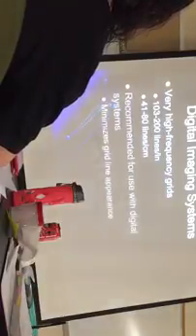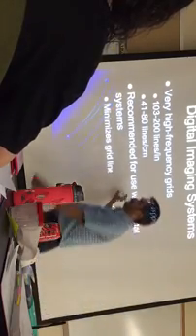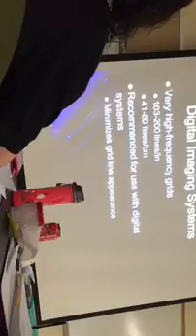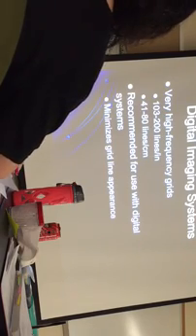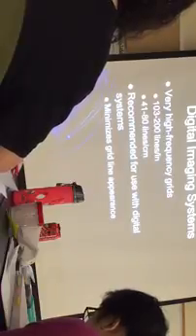Also, very high frequency grids can have from 41 to 80 lines per centimeter. If you're using a digital system, it is highly recommended that you use high frequency grids. High frequency grids meaning at least 60 lines per centimeter. Write that down, that's important. At least 60 lines per centimeter when you're using a digital system. If the grid is not at least 60 lines per centimeter, you end up with a problem.